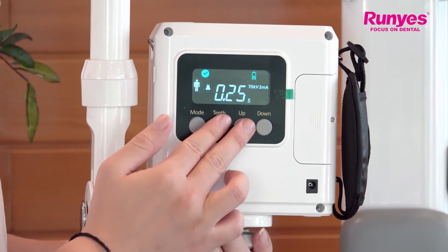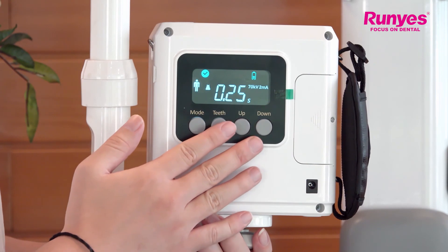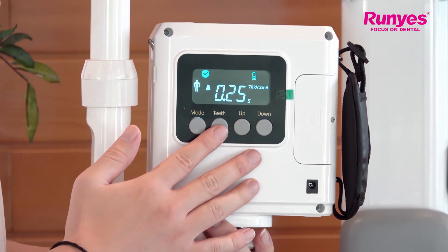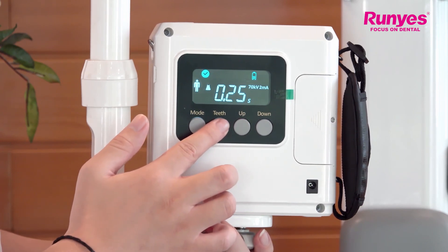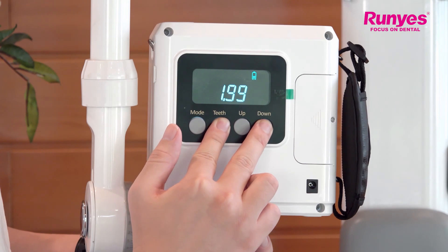When we release these two keys, the data will disappear. If we want to check the current of the last exposure, we can press the teeth key and the down key together. You can see that it shows the current of the last exposure.